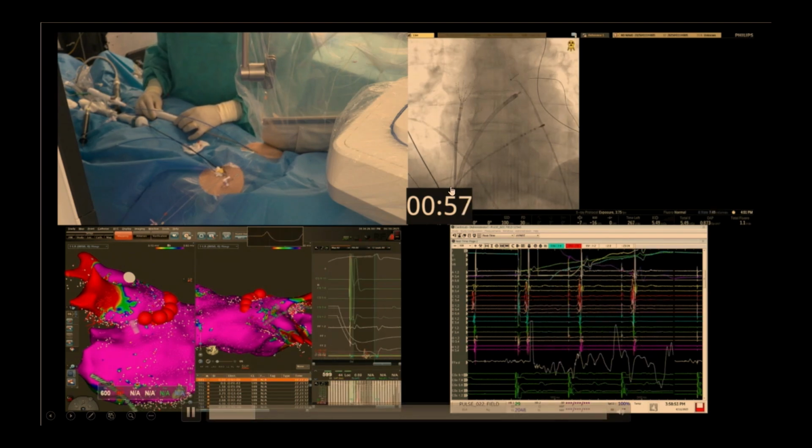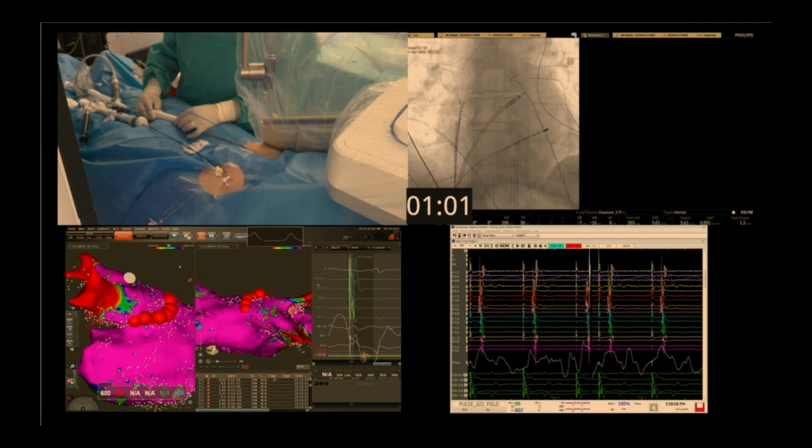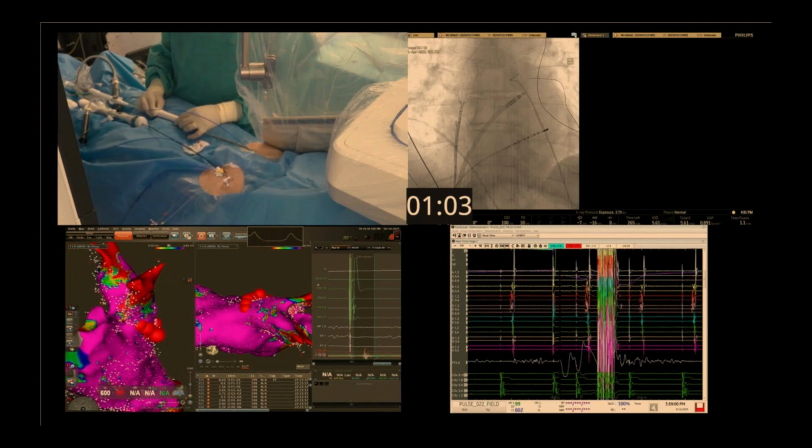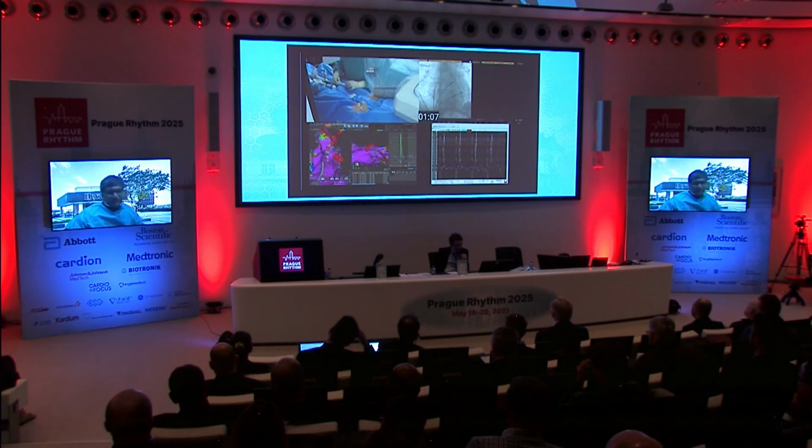By the way, the workflow is presenting well. Even with the problems you had, you went around that vein very quickly. How many trains are in each delivery? Yeah, I don't know any details.